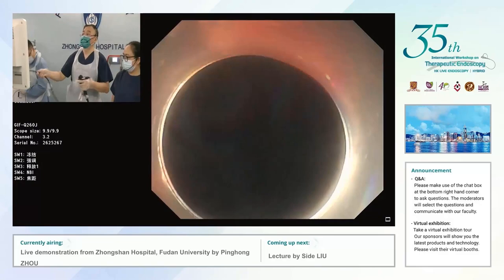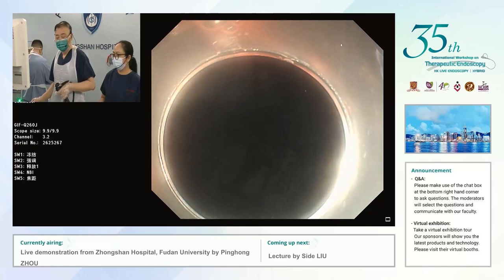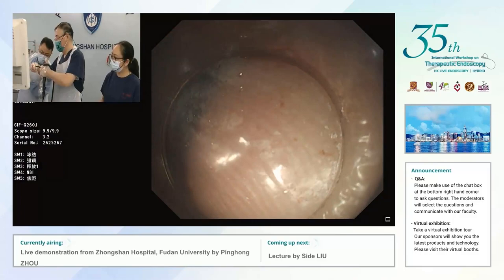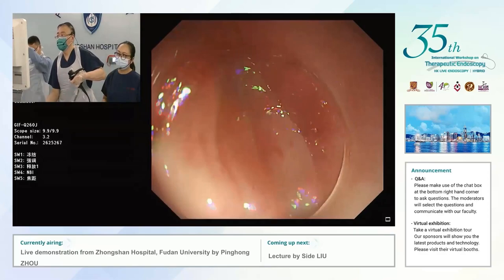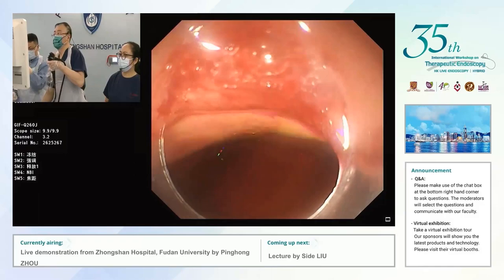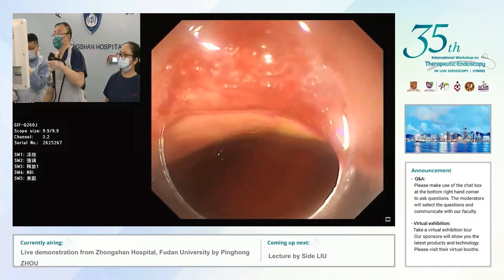In the past we would change to a double-channel scope to use the end loop and the clips. Now we are using a single channel with the loop fitting outside the scope. I just fix the end loop to the cup, then put the end loop into the stomach, proceeding the scope with the end loop mounted on the tip. Then release the end loop into the stomach — so there's no need for a double-channel scope.